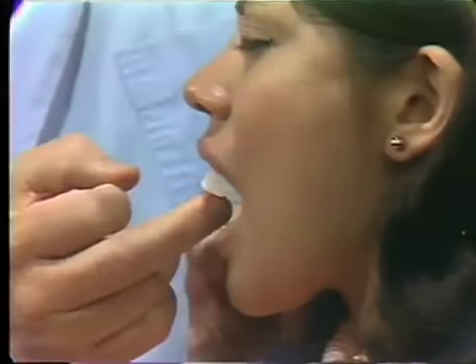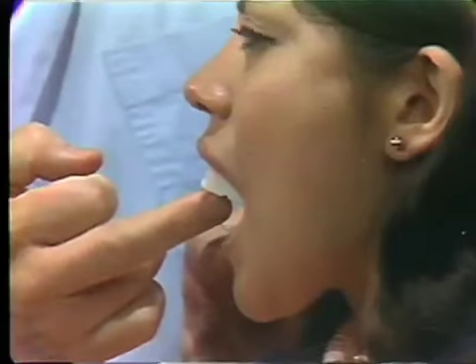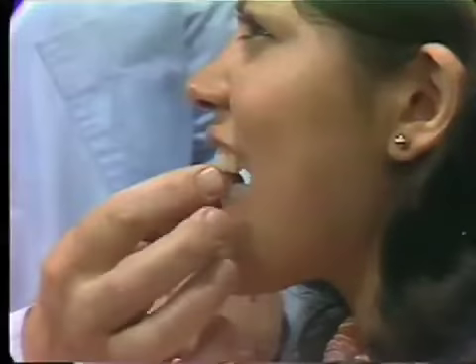Now this is how I want her to hold the film, so that I can get my finger out. We ask her to gently close. All right, fine. She's biting well out toward the end of the block. So that is the first of the 5 steps, positioning of the film in the block.